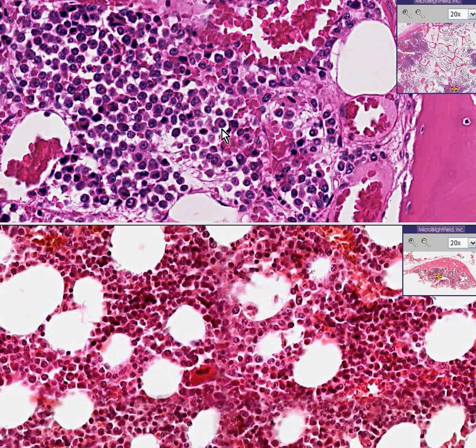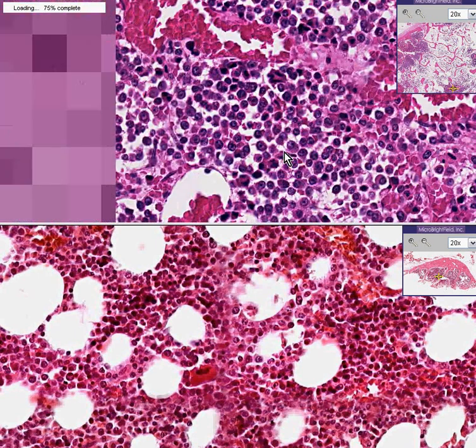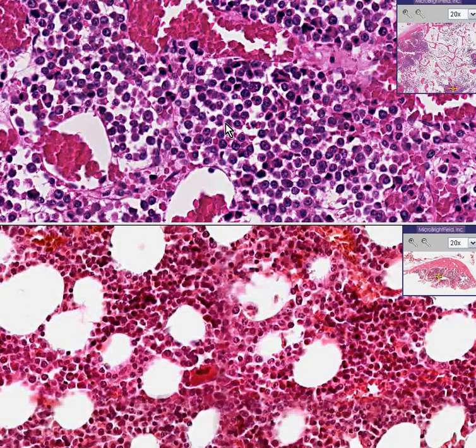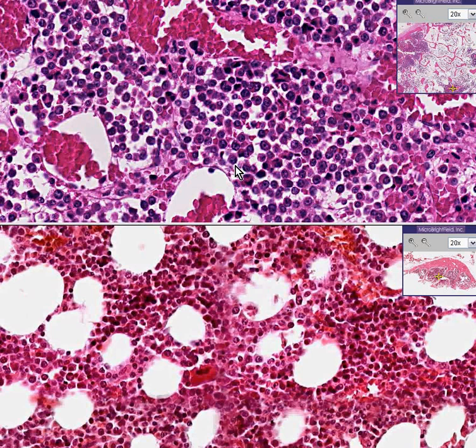Look — there's a classical plasma cell. There's another classical plasma cell. The thing about multiple myeloma is that even though it's a destructive malignancy producing monoclonal immunoglobulin or immunoglobulin fragments, the cells themselves may look, in most cases, like totally normal plasma cells. In some more advanced or worse-differentiated myelomas, the plasma cells don't look like plasma cells at all, but usually they look like normal classical plasma cells.